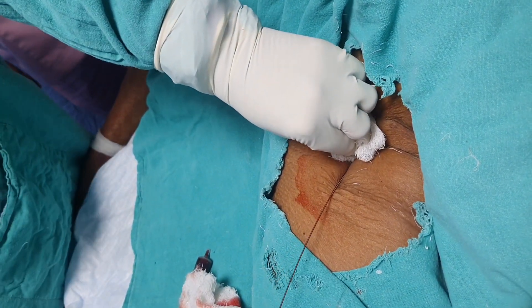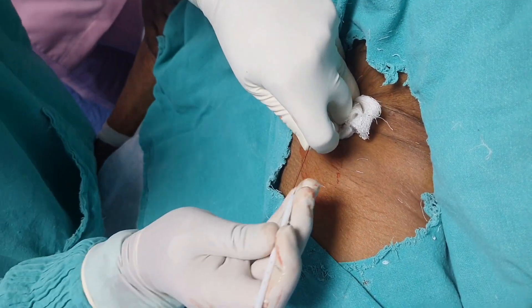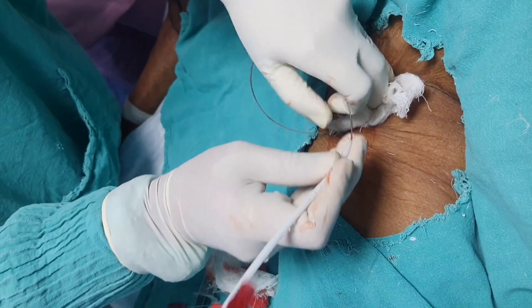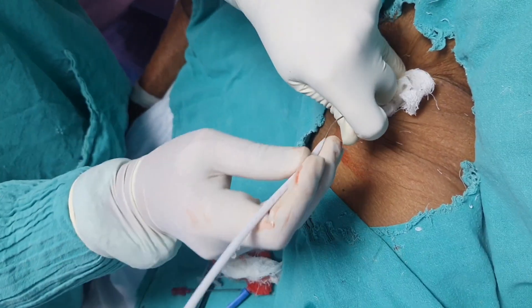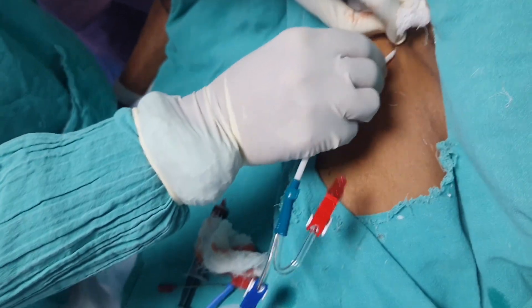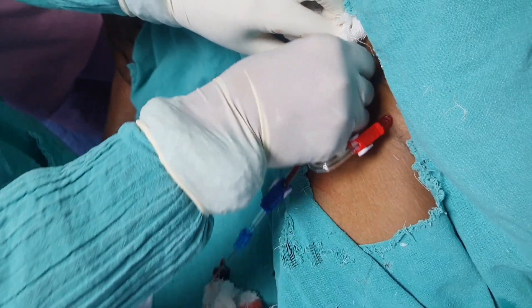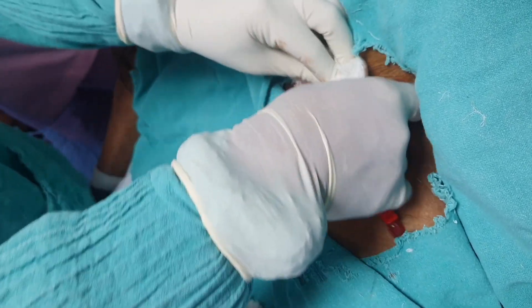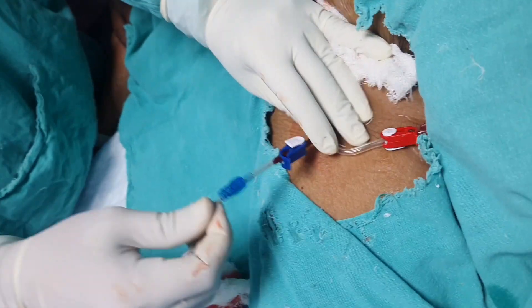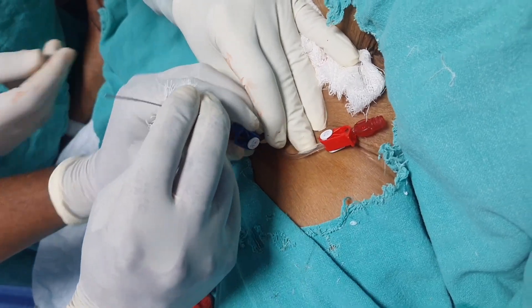Now we will insert our dialysis catheter. The guide wire will come out through the blue port. You can see the tip of the guide wire coming through the blue port. Now we will remove the guide wire. After removing the guide wire, we will close the button, otherwise blood will spill out.